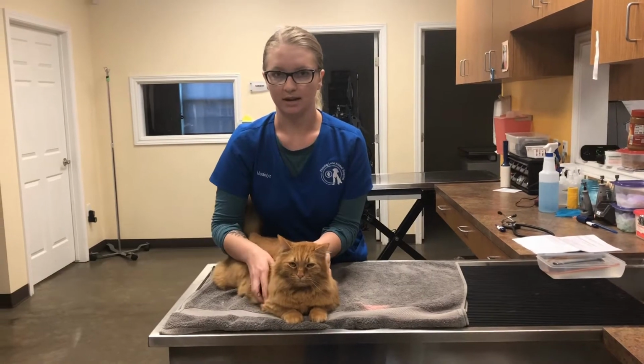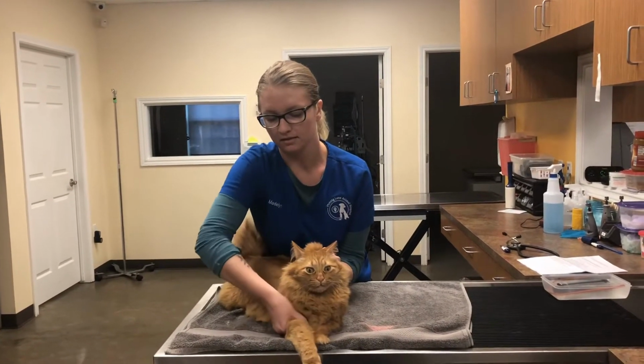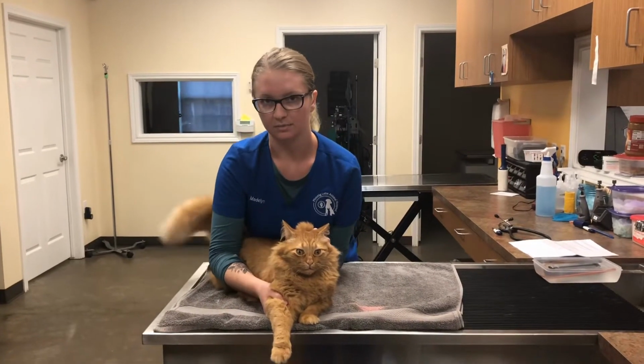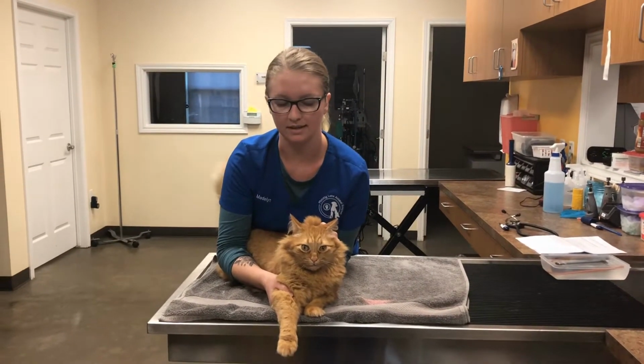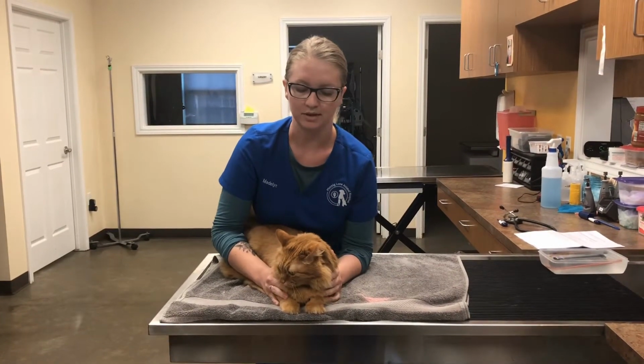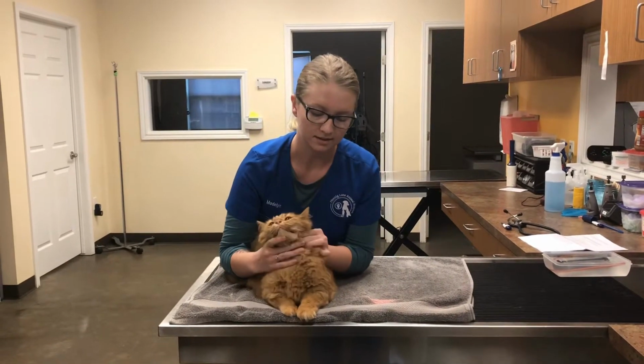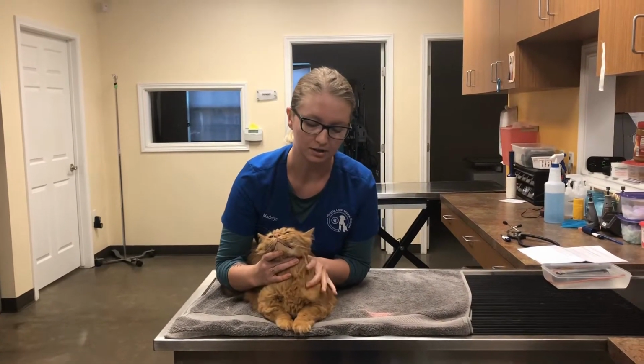And with my dominant hand, I'll extend his elbow forward, which is exposing the vein, and then I'll occlude the vein here. I'll be sure to keep my body behind him so that he can't escape during the blood draw. For jugular, you can keep him sternal as well, and so you just lift his head and expose the jugular here for your blood drawer.